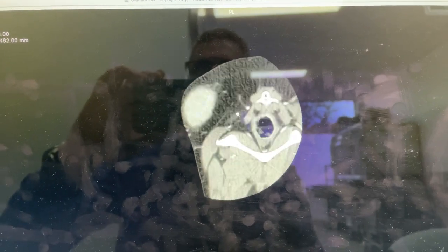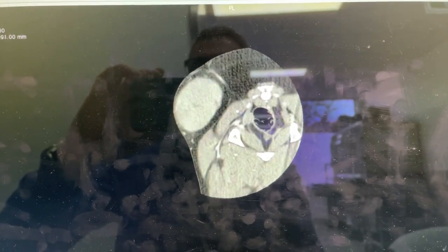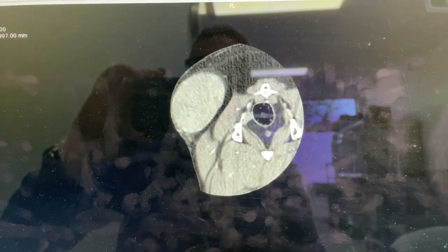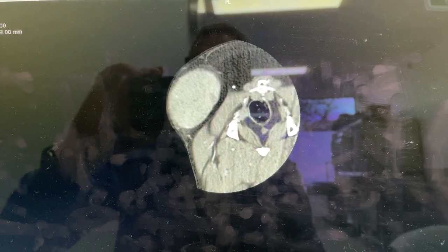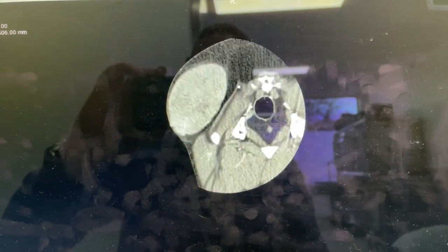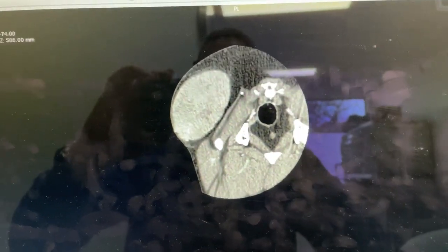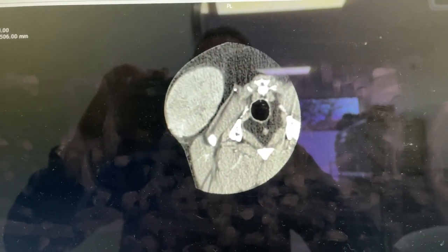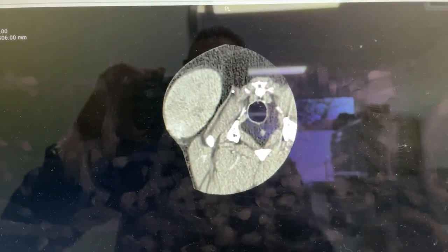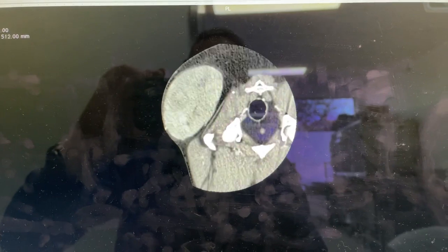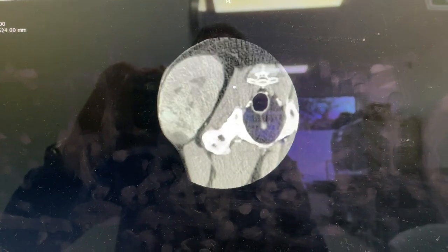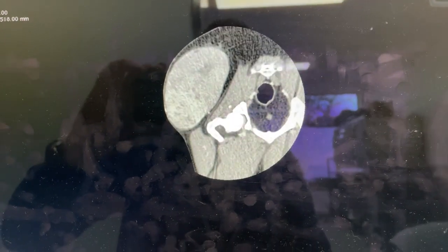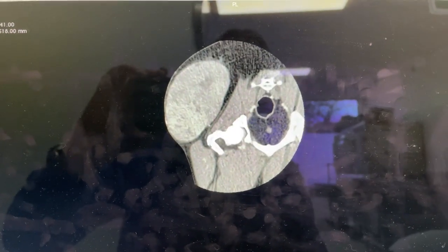And then as we head further cranial, you can start seeing the mass right here. There's a large blood vessel coming into the mass, like a branch of the deep circumflex iliac vessel. And so we can see that it's overlying the greater trochanter.